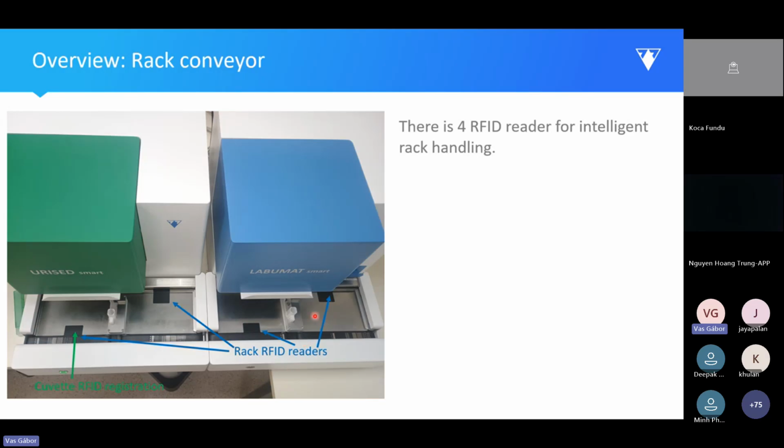It's almost impossible to flip a rack over, so don't put anything on the side, because unlike the big automated systems, so 3 Pro and LABUMAT 2, here, if you spill something on the rack conveyor and it goes underneath the start position, then there is a printed circuit board. It will be a very, very expensive repair. So make sure there is no spillage on the rack conveyor.